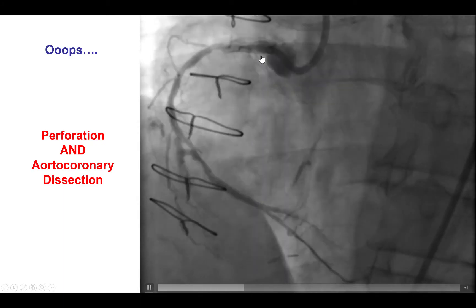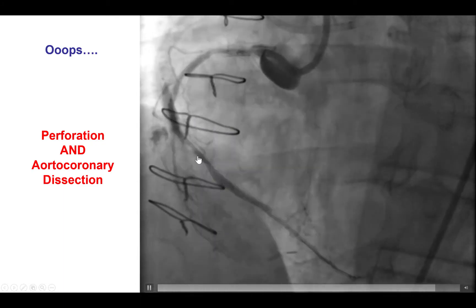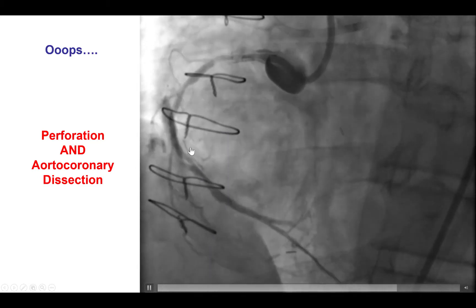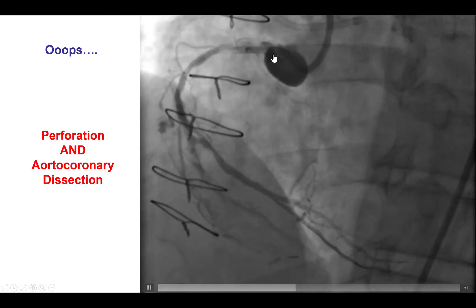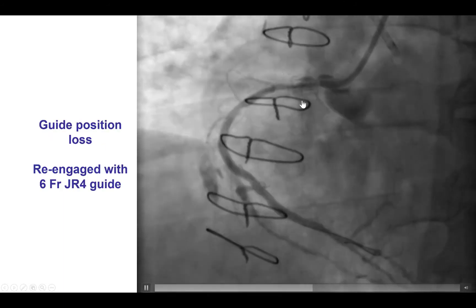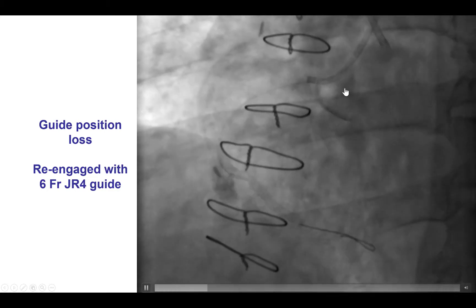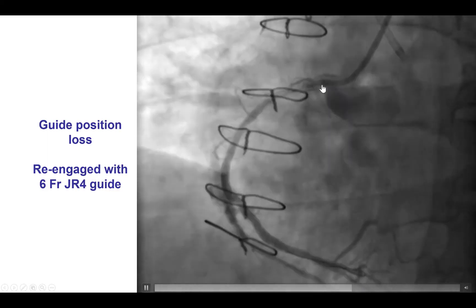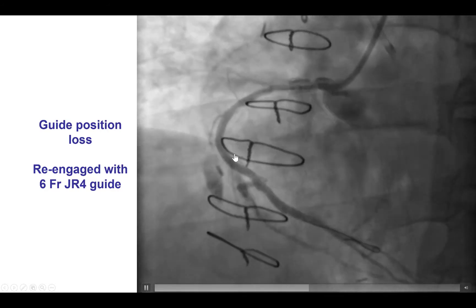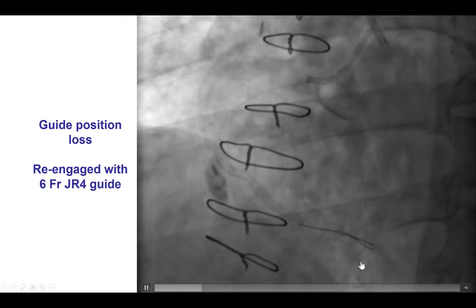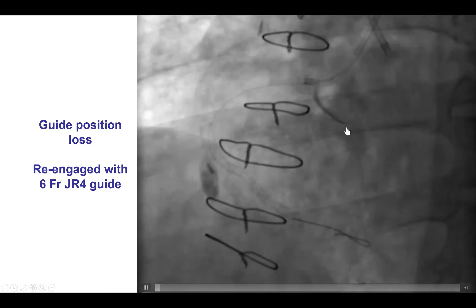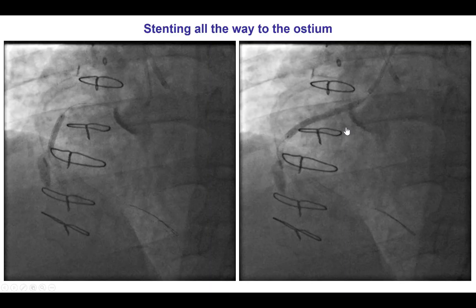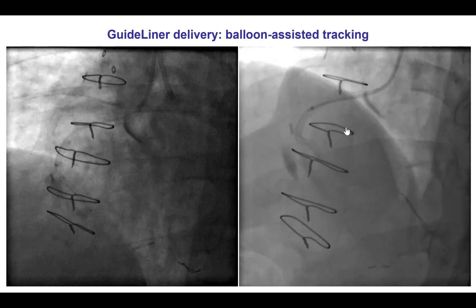This is one of those unique situations when bad things happen together. We had two different problems: a perforation, and a dissection that threatened to close the proximal part of the vessel. The key in this situation is to avoid losing the guidewire, which unfortunately happened in our case during an attempt to remove the Amplatz guide catheter. Fortunately, we were able to re-engage the right coronary with a JR4 6-French guide catheter, advanced the guidewire without injecting contrast, and then did a very gentle injection. But even with that, you can see there is filling into the sub-intimal space. We therefore placed stents without any further injections — that is the key with aortocoronary dissection: avoid repeat injections because they can propagate the dissection and hematoma.